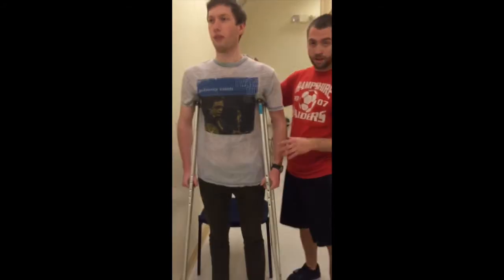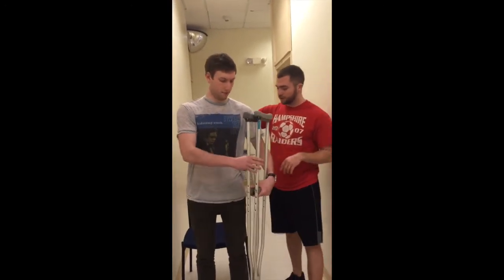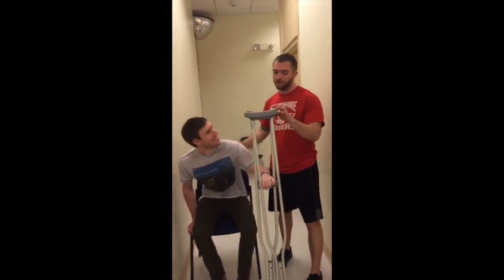Will's all set. But if I did, Will, can you please grab that crutch, put it in your right hand, or your left hand rather, and we're going to sit back down. So scooch on back so you feel a chair. Good. Okay, perfect.